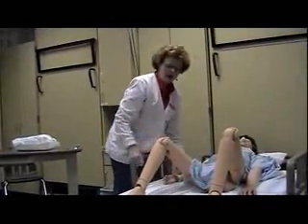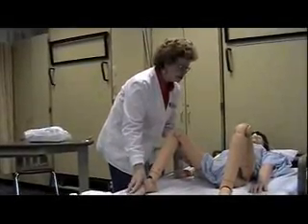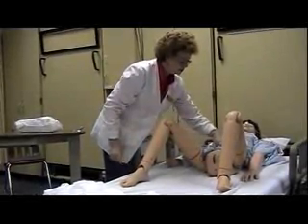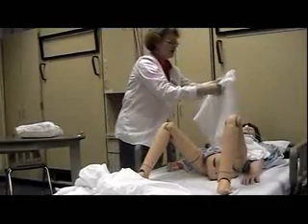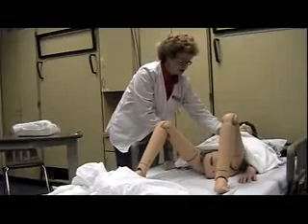I will also get Mary into the lithotomy position so she will be ready for when I have my catheter materials. I will pull her gown back and use a bath blanket on the top part. Sometimes just covering their top makes them feel like they are not completely exposed.